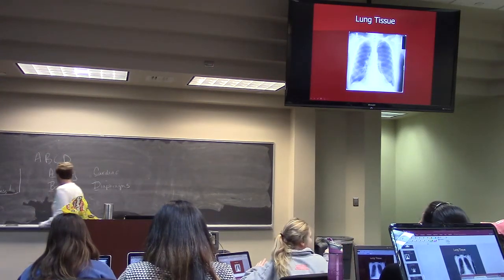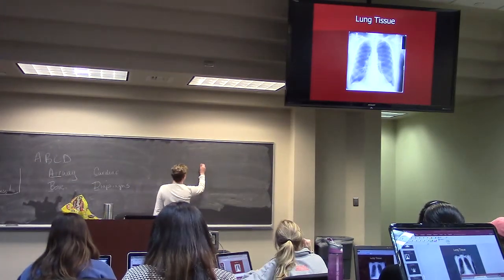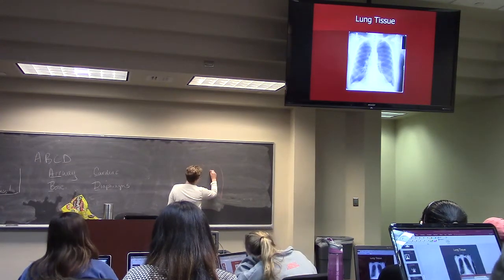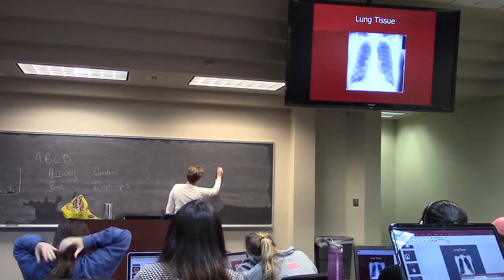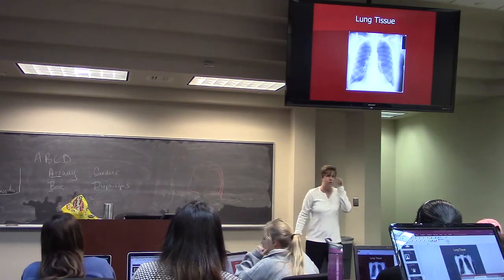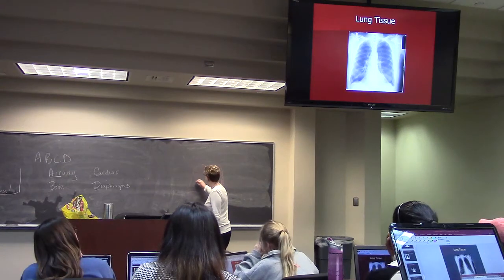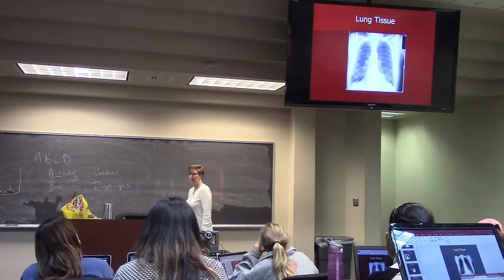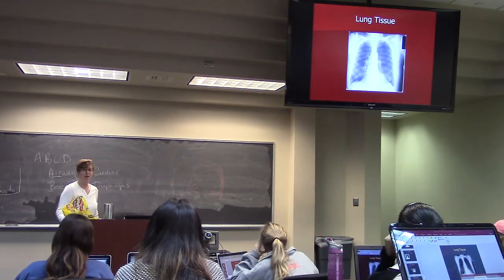So I have tissue, I have a lung cavity, that the lung is in here. This is air, right? There's air there, where there shouldn't be. This one is, there's tissue coming out, there's blood flow coming all the way out. That's a pneumothorax. You always look for that line or a line.